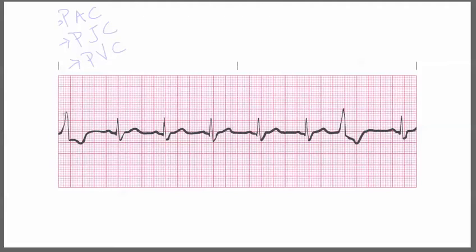As always, we're going to count our rate: 1, 2, 3, 4, 5, 6, 7, 8. We have a rate of 8 — 8 times 10 equals a heart rate of 80. So this person has a heart rate of 80.